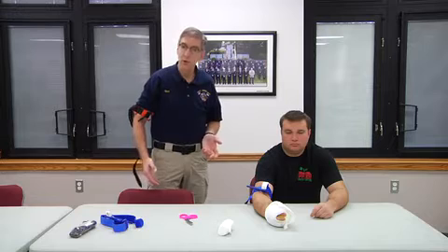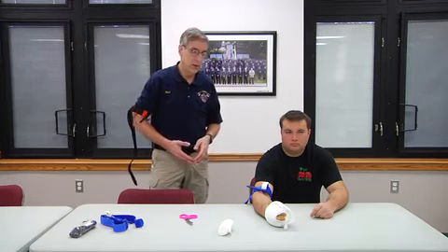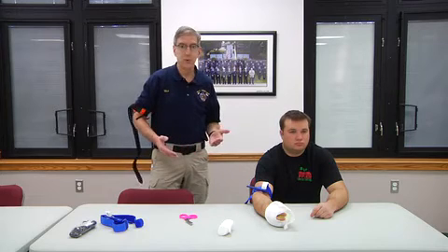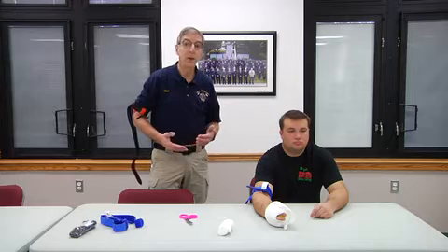So that's a drill that you could do in your training center on self-application of a tourniquet by a firefighter, not a situation that necessarily all of us are prepared to do, something that we really need to train on.